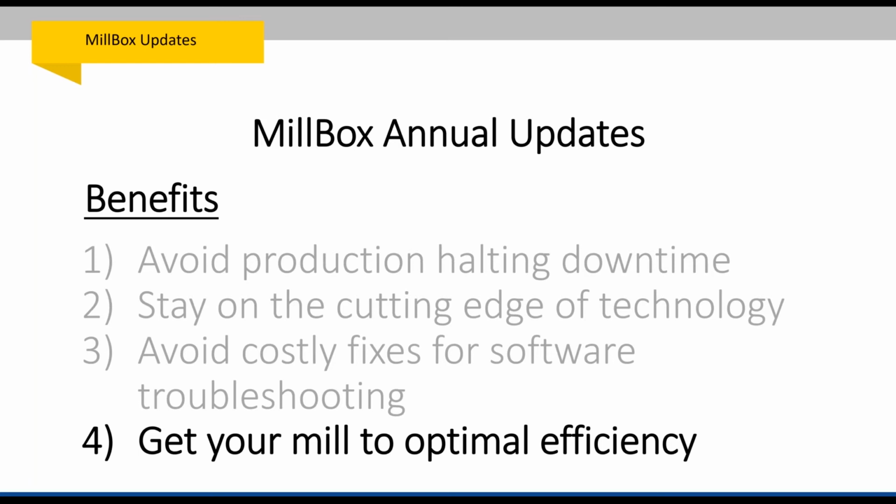It used to be that each lab or each clinic really needed their own engineer, their process engineer, to make things more efficient in their lab. And there was a lot of work that went into that. Of course, a lot of time and a lot of money. These days, what Millbox has decided to do is to take that feedback from all around the world, and we implement strategy changes, and we share those with all Millbox users.